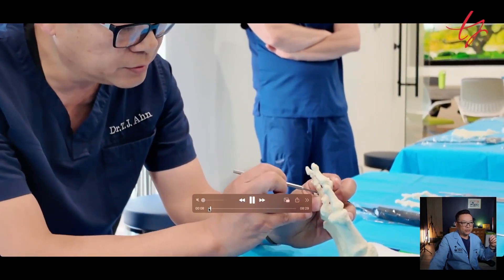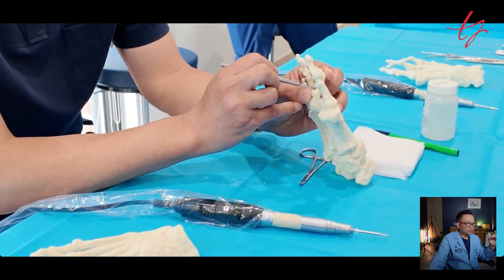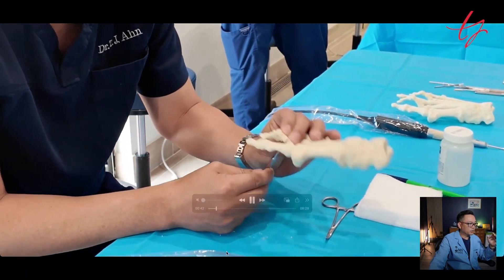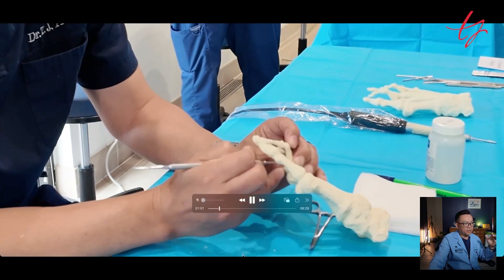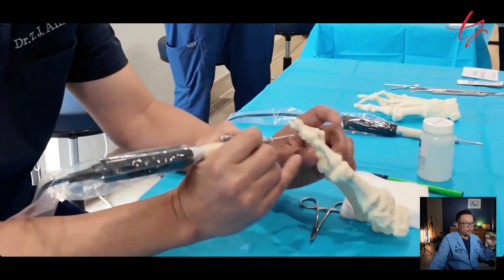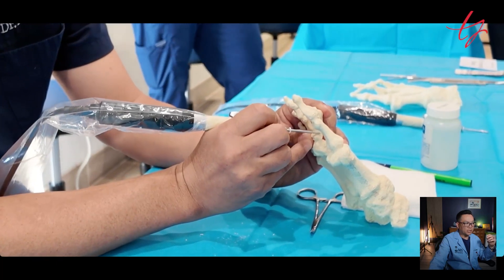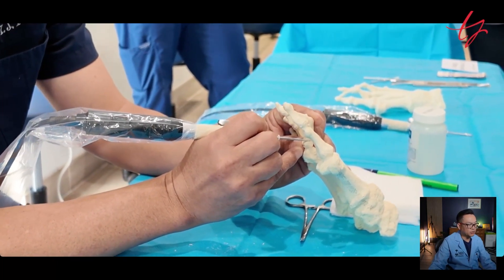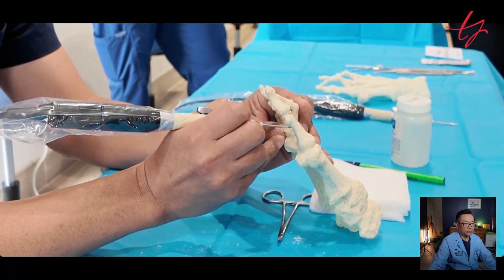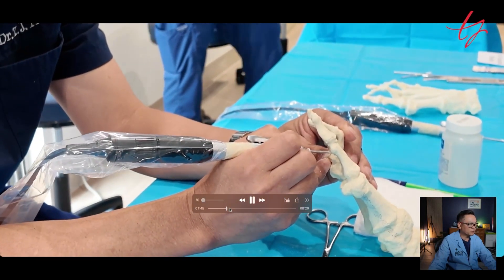The first step is the incision — you need to know the incision portal. For this proximal phalanx osteotomy, I use a plantar approach, but I'll also show a dorsal approach. After the incision, do a rasp, use an elevator to create a portal safely without sharp instrumentation, and then rasp to roughen up the cortical shiny, slippery area of the bone. I'm aiming at the flare of the base — that's where you introduce the MIS drill set. The non-dominant hand stabilizes the toe and creates a plantar flexor force, producing a plantar flexor wedge to drop down the typical hammertoe deformity at the base. Notice I'm not touching or destroying the joint — this is an osteotomy of the base of the proximal phalanx, cutting from medial to lateral.